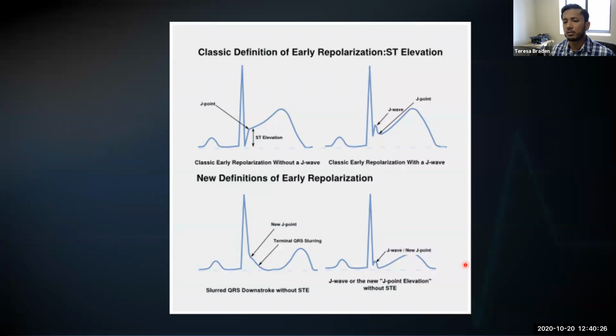This is the same exact image. I just put it in a different slide and increased the size so it's easier to see, because it might not be the easiest over slow internet connections or based on the monitor size. But again, we see this ST segment elevation. We know that we're going to monitor that 1 millimeter or more measurement to make that definition at the J point. And then we're going to look for the little notching that occurs on the descending QRS, as well as some slurring that can occur, as being some of those markers that we can be concerned about for making that diagnosis.